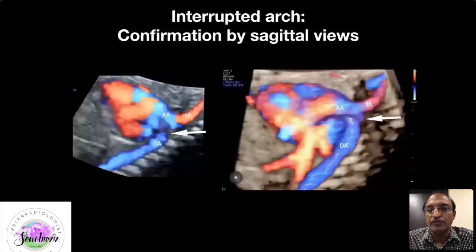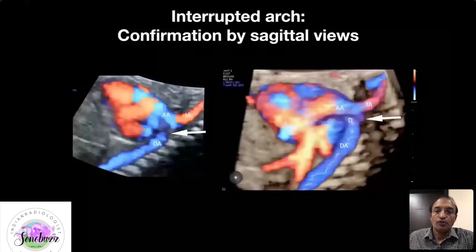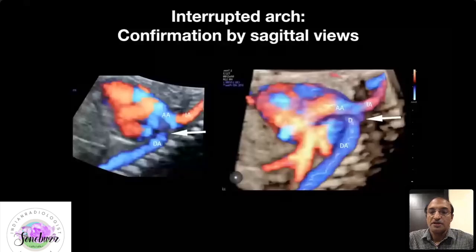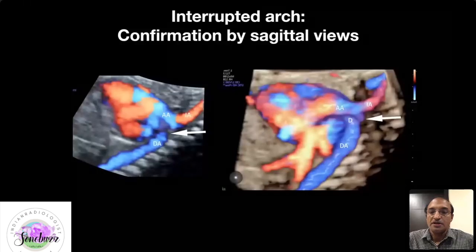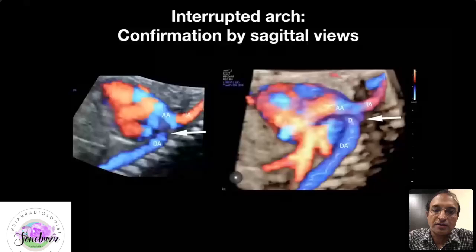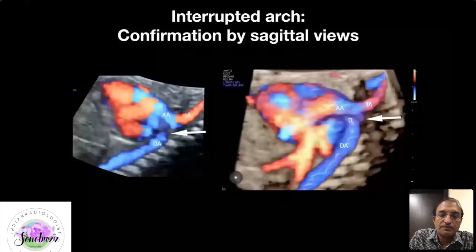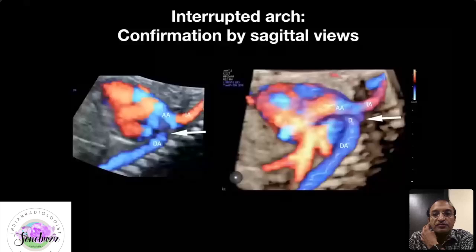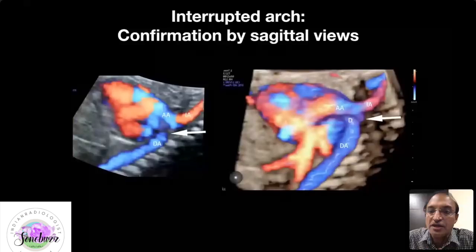The descending aorta is supplied by the ductus arteriosus, shown as D. This 3D rendered picture shows the anatomy with remarkable clarity and was actually published in Circulation as an image on the usefulness of 3D technology for the diagnosis of interrupted aortic arch. This is a severe but totally correctable condition — the baby was delivered in our center, operated upon, and was about four years old and doing really well.